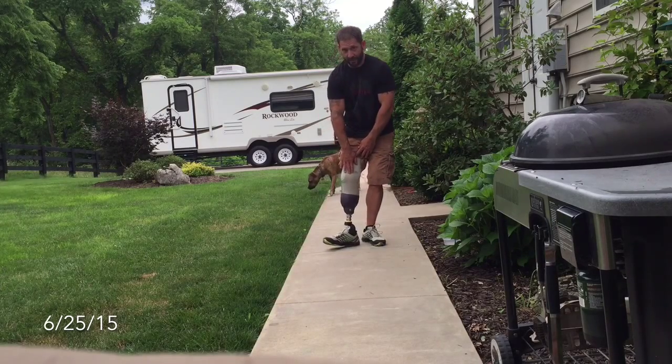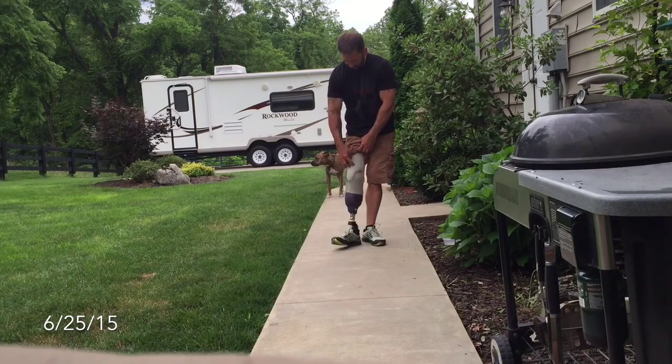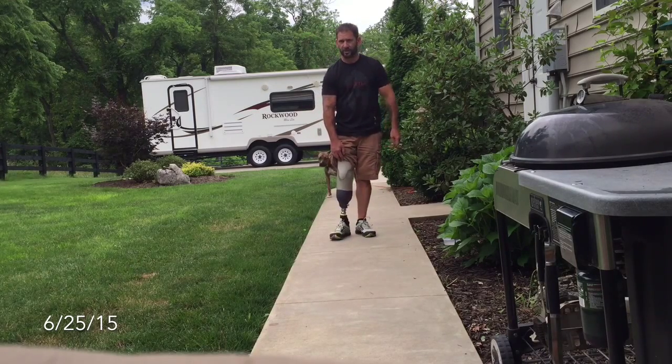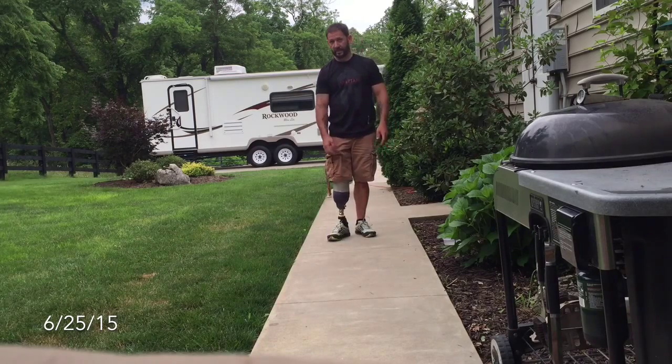I don't have to use that insert I had in there before, so this thing's a lot lighter too. Now I'm just using my liner and pin lock system right into the socket, but throughout the day I'm still going to get some reduction. I have to put some socks on. I'll see John, my prosthetist, at the end of this month — end of July, so a month from now.